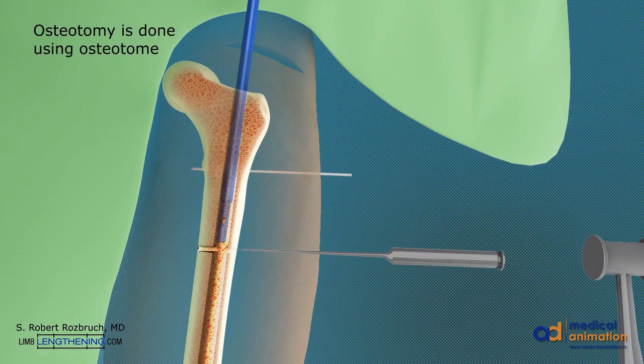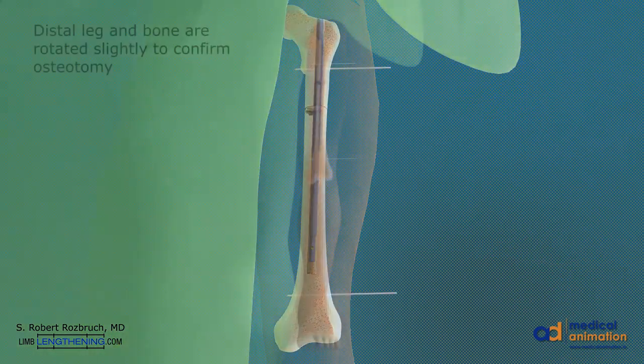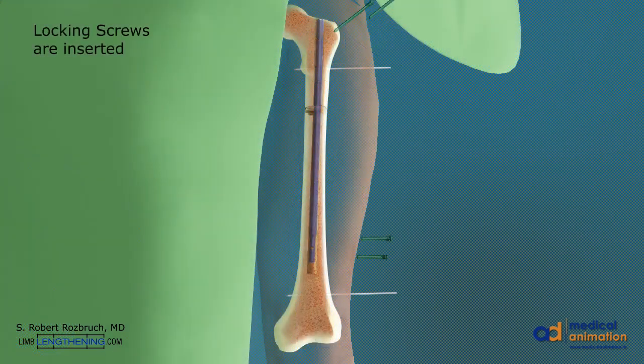The precise nail is then inserted up to the osteotomy site. The osteotomy is then completed using an osteotome. The precise nail is then passed across the osteotomy site until the distal end of the femur. The distal leg and bone are rotated around the nail to confirm a complete osteotomy. Locking screws are then inserted after the correct rotation is confirmed.